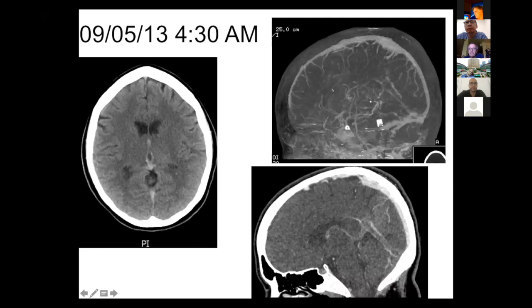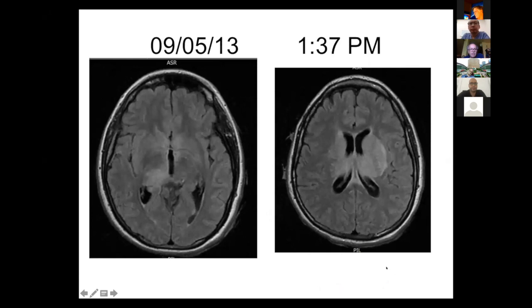There is hyperdensity of the internal cerebral vein. The longitudinal sinus is still open. The inferior longitudinal sinus appears patent. The most important finding is the thrombus in the straight sinus. In the afternoon, just before the angiography was performed, I decided to put the patient in the MRI.